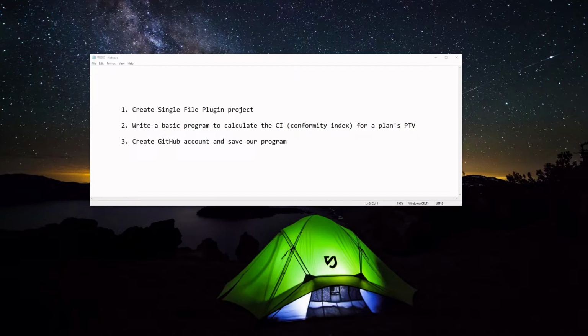But if you are, or if you just want to see what it's all about, in this video we're going to actually begin our first project. And so on the to-do list we have, I want to create a single file plugin script or project, and then we're going to write a very basic program that will calculate the conformity index for a target. And then after we do that, we're going to create a GitHub account and save our program or our repository. So if you're ready, then let's just get started.